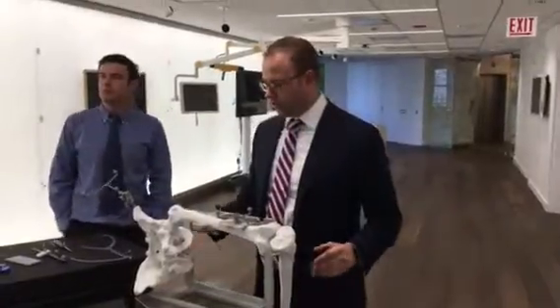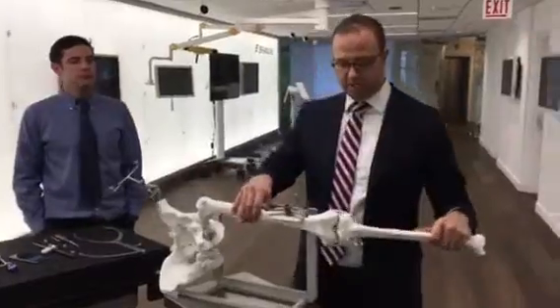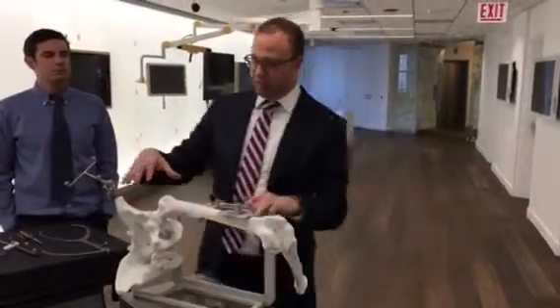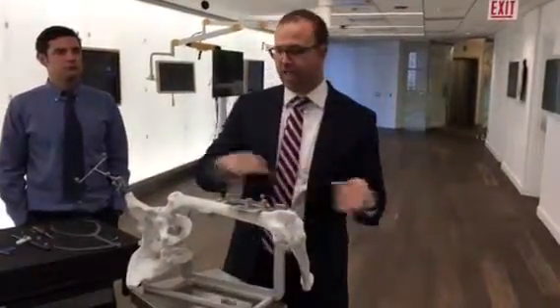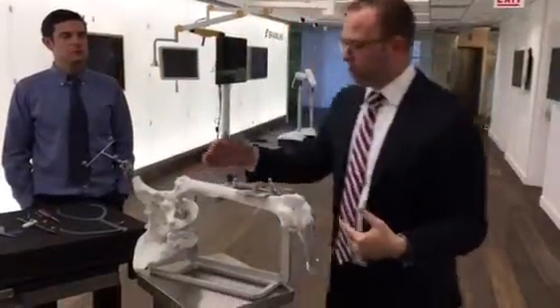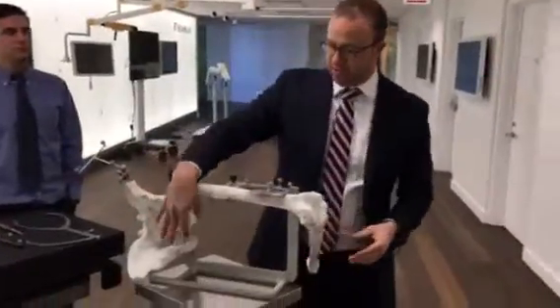Yeah, you're live. So this is the new Hip6 version of software, and what the software does is the first hip that allows you to take the hip procedure and take them in lateral and do the entire procedure without having to return. And in the older versions of software, you used to look at the anterior pelvic plane, which is the ASISs and the pubis.